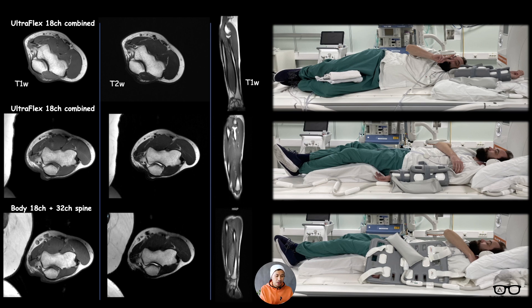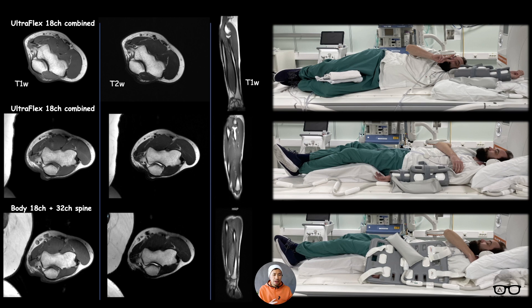The Body 18 channel couldn't quite handle it — the quality is okay but not great. However, if you tailor your sequence to that specific coil — gaining a little more SNR at the cost of a slightly longer scan time — then using the Body 18 is also possible.